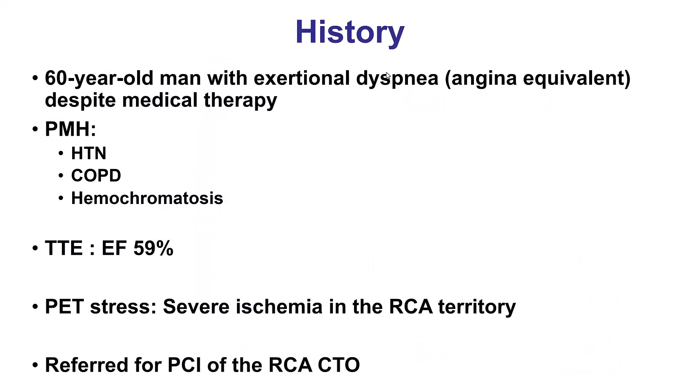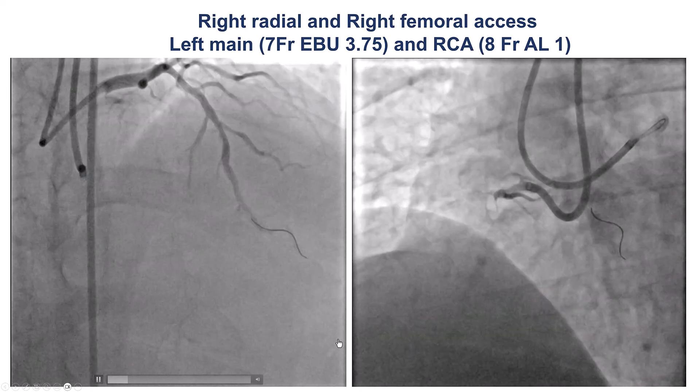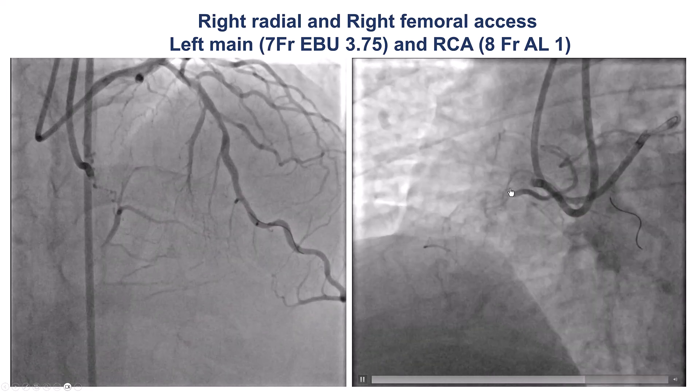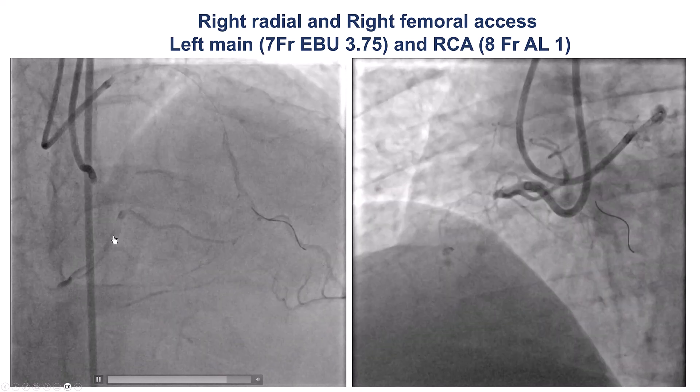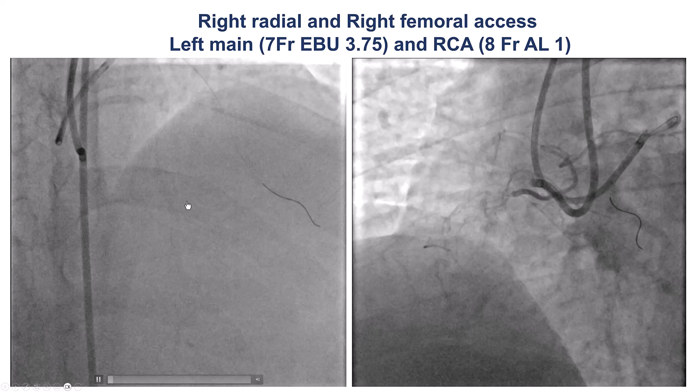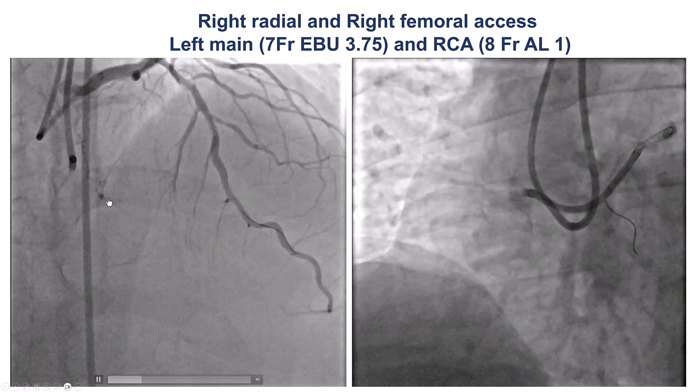The patient was a gentleman with exertional ischemia, considered to be an angina-equivalent, with ischemia in the inferior wall, and was found to have a right coronary CTO. The coronary angiogram showed a blunt proximal cap, long occlusion length, a vessel that looks okay distally, and both septal as well as some epicardial collaterals.